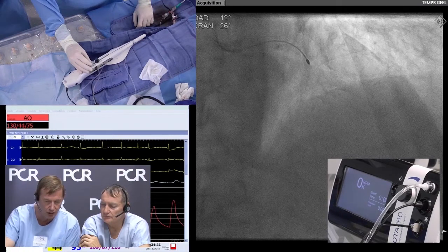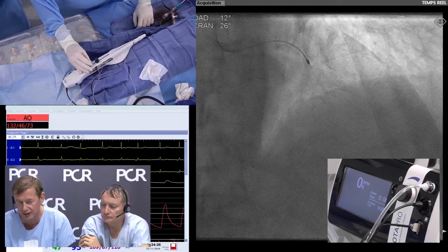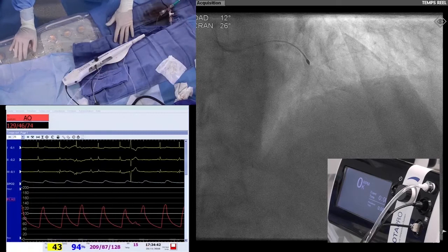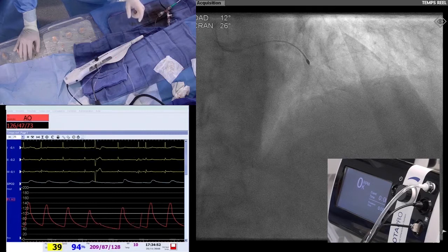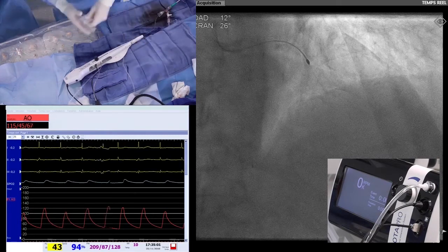Perhaps, Didier, you could answer. There's been a question about whether or not a pacing wire should be required in a case such as this. Okay. We stopped pacing the patient maybe 4 or 5 years ago, maybe more, because finally it's very short. We perform a very short rotablation, 10 seconds, sometimes 15 seconds, no more. We wait, and if needed, we can inject atropine.